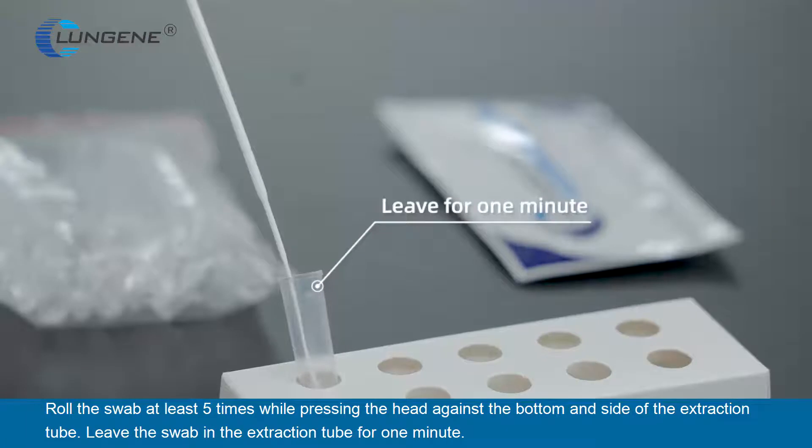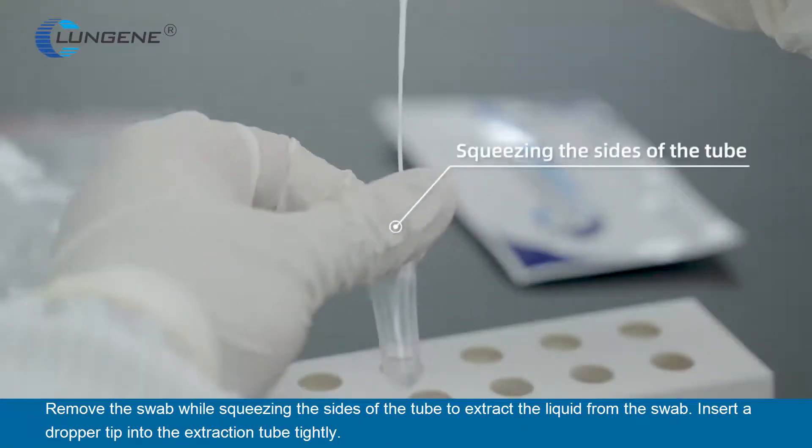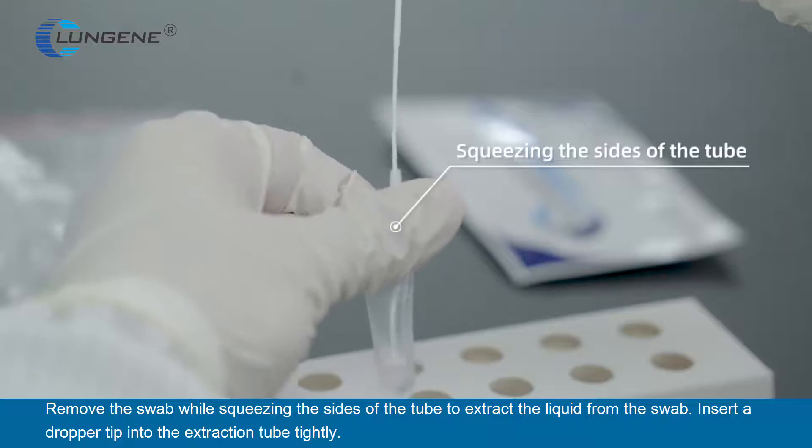Leave the swab in the extraction tube for one minute. Remove the swab while squeezing the sides of the tube to extract the liquid from the swab.